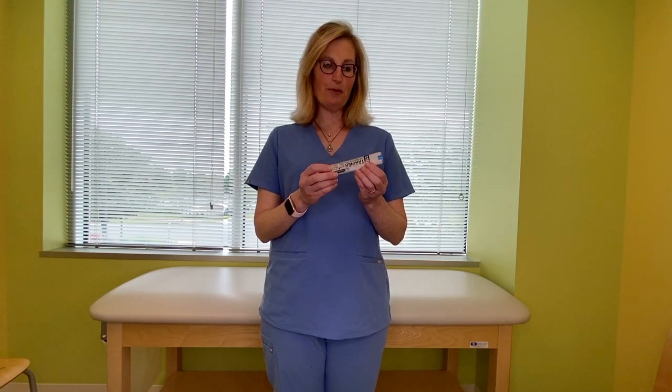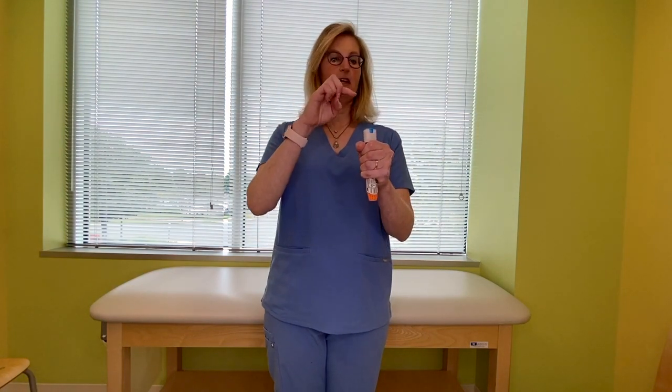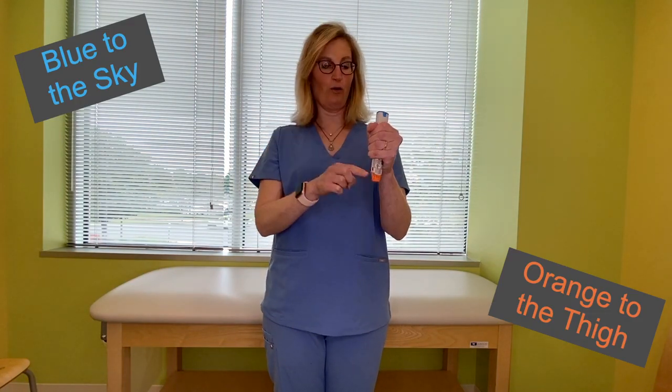The way we use it is you hold it in your hand. Don't put your thumb anywhere because you don't want to accidentally inject the medicine into your thumb. Just hold it with your fingers all together. And I have a mnemonic to remember what to do: blue to the sky, orange to the thigh.